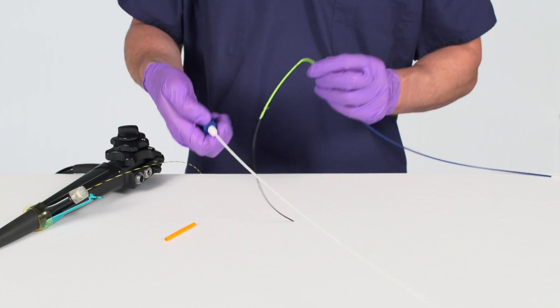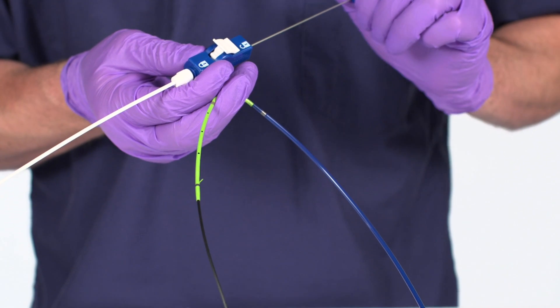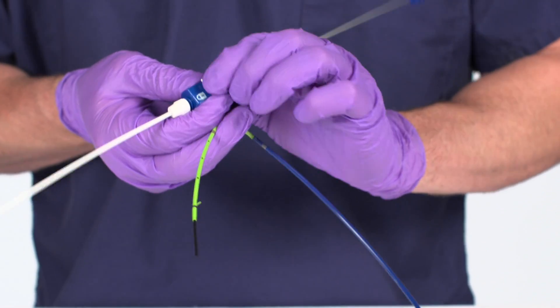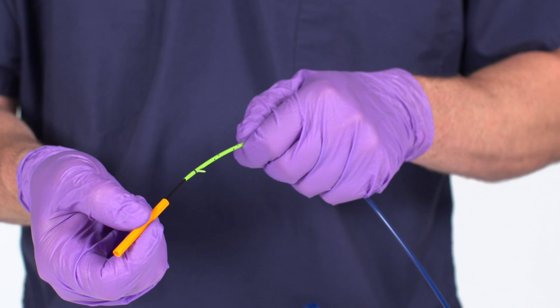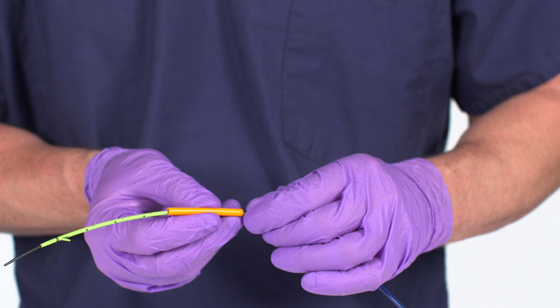Pull back on the pull wire cap to adjust the length of the guide catheter in front of the stent, and engage the Naviflex RX Delivery System locking mechanism. For trailing barb stents, slide the stent barb cover so it is on the distal end of the blue push catheter near the stent.